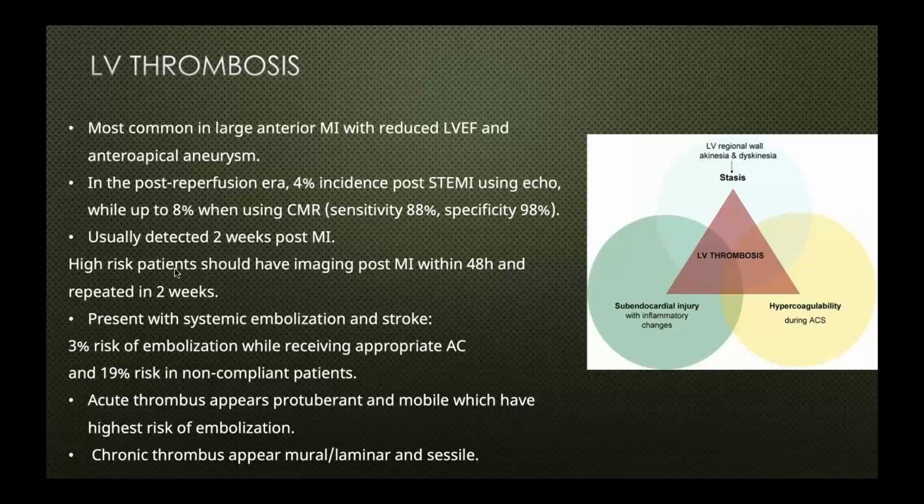So it's very important that these patients have an echocardiogram in the first 48 hours after their MI presentation, and their echo should be repeated again, and if negative, in 2 weeks, and these echocardiograms should be done enhanced by contrast.